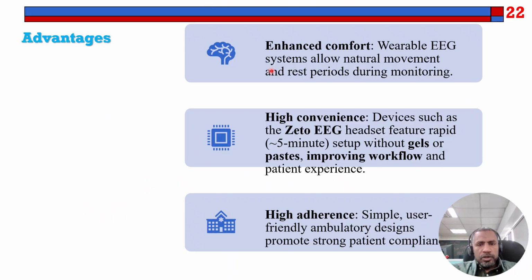Okay, advantages of EEG. One advantage is that it enhances comfort. Patients feel comfortable when wearing the EEG system. It allows natural movement, rest periods during monitoring, and also has high convenience.